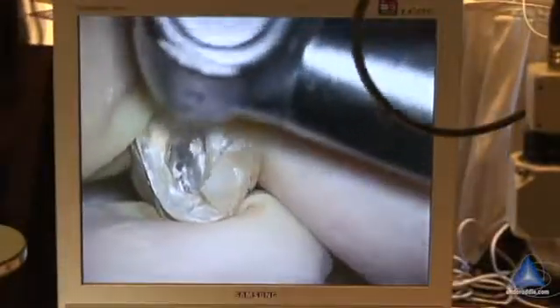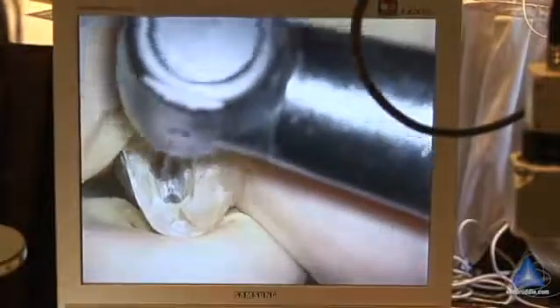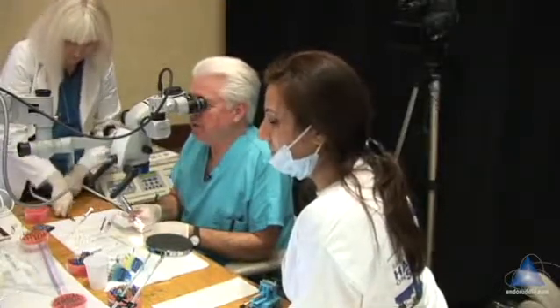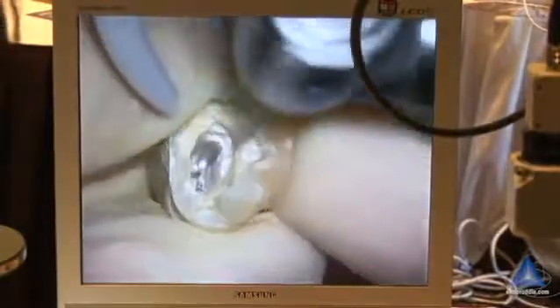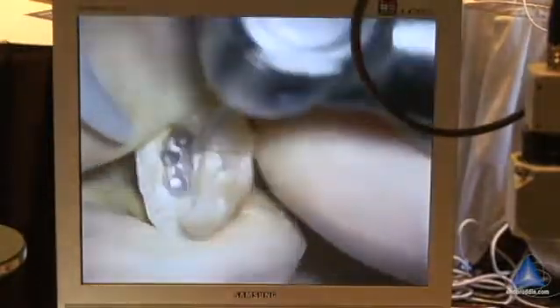Let's get some air right in there so she can see a little bit better. Now I'm going to come in with this — I'm hugging that wall, brushing a little bit more. That's better. I'll take a 4 and finish with a 4. You're going into the small canal too with a 4? I'm going into all 3 of them. Start way up high so you can just get that transition — see how we can come right down in there. Ramp this a little bit, just come up the lingual. Directly right there.